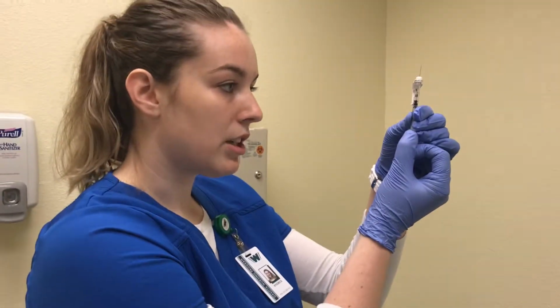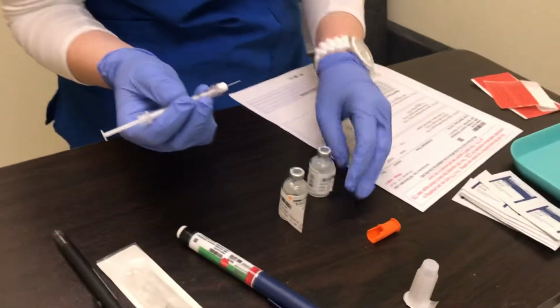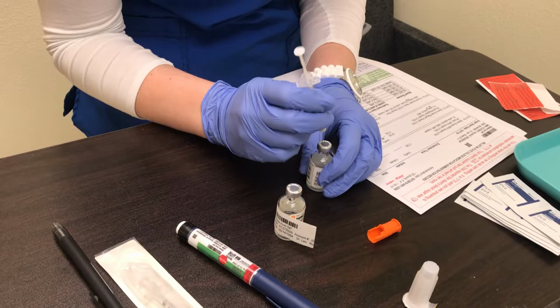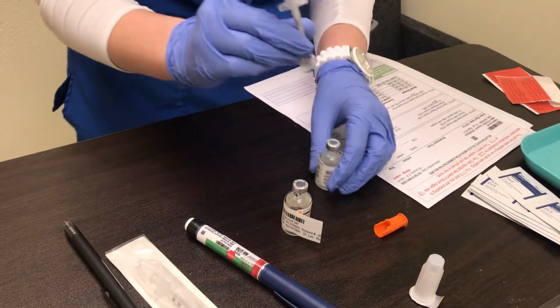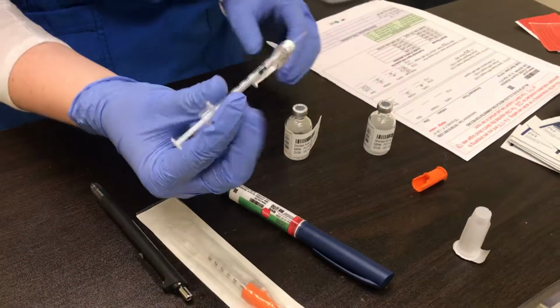So there's my 15 units of air. And then I will inject it into my NPH. So I have my NPH here, and then just inject my air. Okay, and then I will need 10 units of air for my regular. So I have my 10 units of air and I have my regular insulin here.